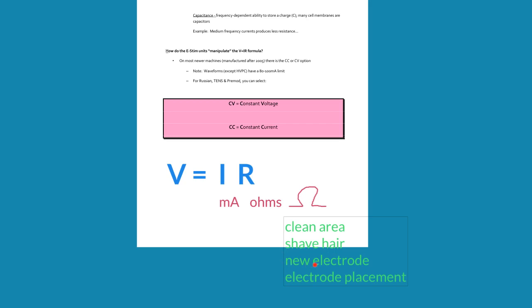Certainly, this is something that gets ignored sometimes, is using old electrodes. Sometimes clinicians are trying to save money, and so they may use an electrode 8, 9, 10, 11 times before they rotate in a new electrode. So using a high quality electrode and trying to limit that to generally less than 6 to 8 times is generally recommended. So sometimes just replacing the electrode is good.